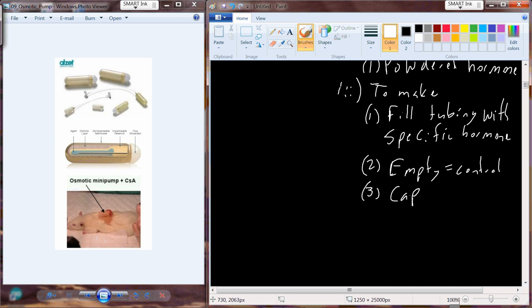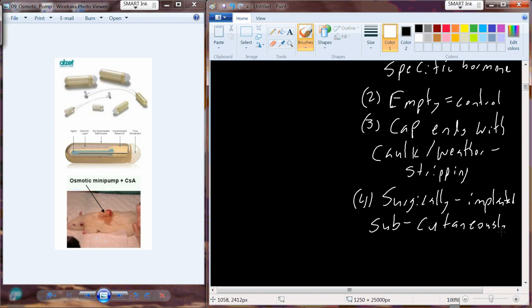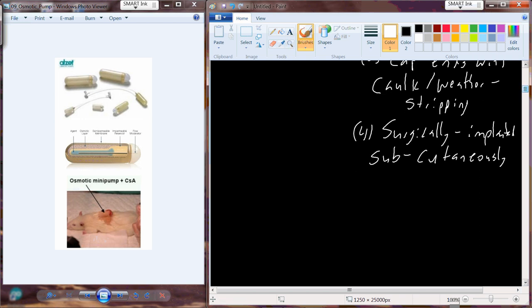Both of the ends of the tubing are typically capped off with something like weather stripping or a caulk. Allow those to dry, so nothing's going to come out of the ends. Everything's going to come out of the pores of the silastic tubing. Again, these are surgically implanted. Typically, a subcutaneous approach is used, just below the surface of the skin. A lot of times we'll put them on the dorsum or on the neck of the animal so they really can't reach them and try to pull them out.